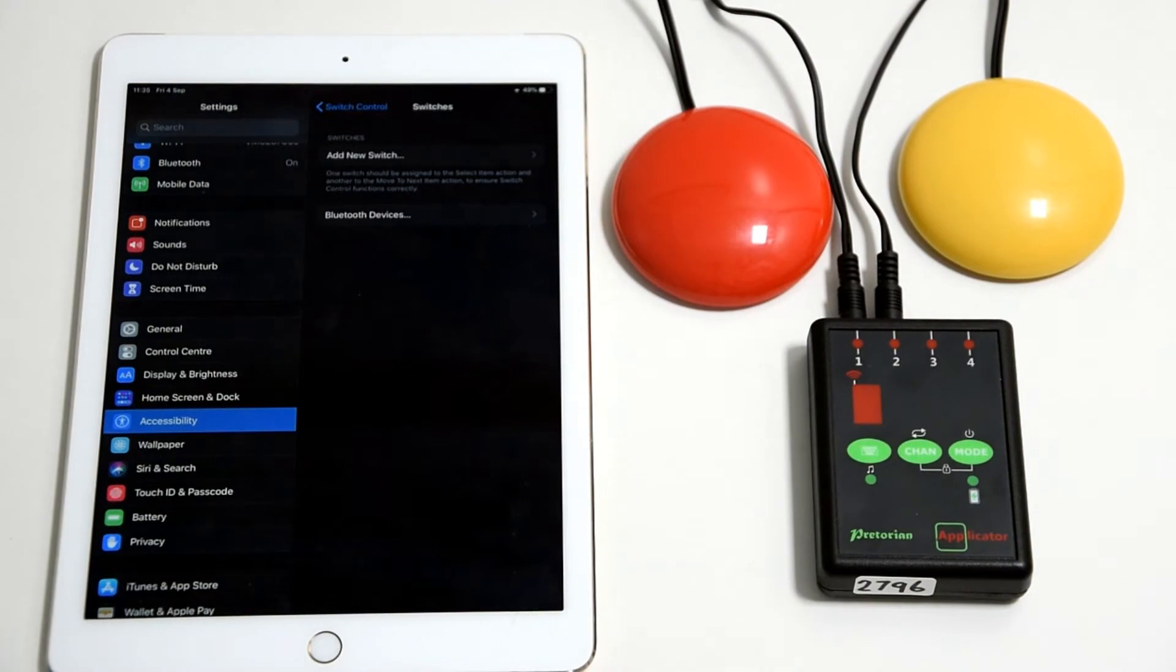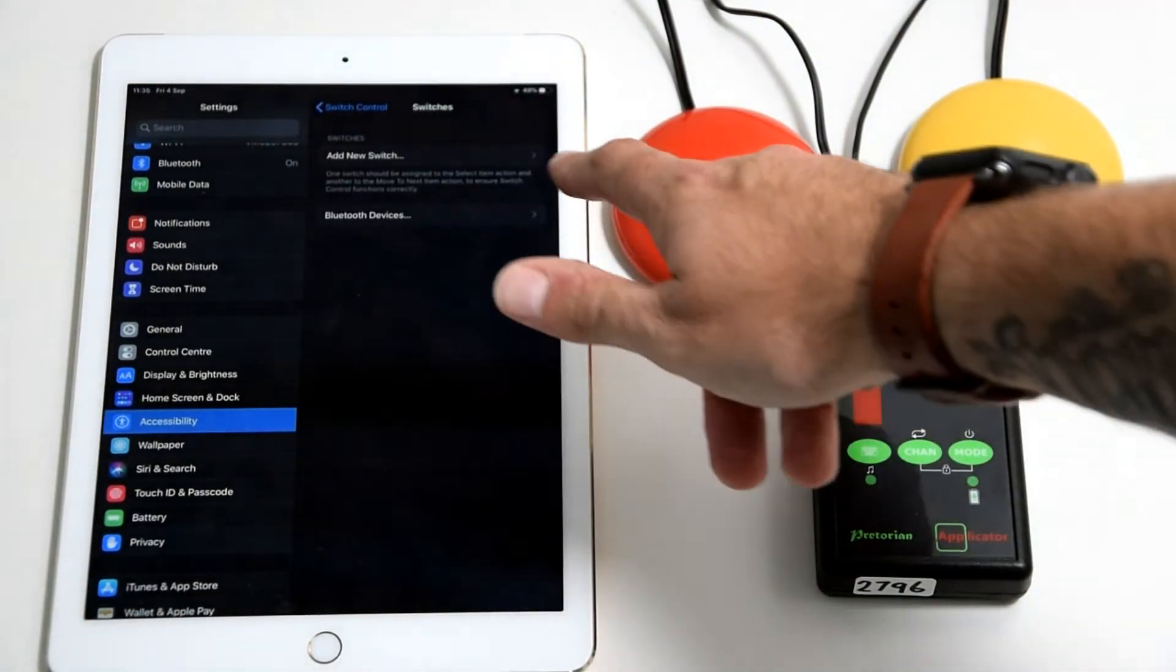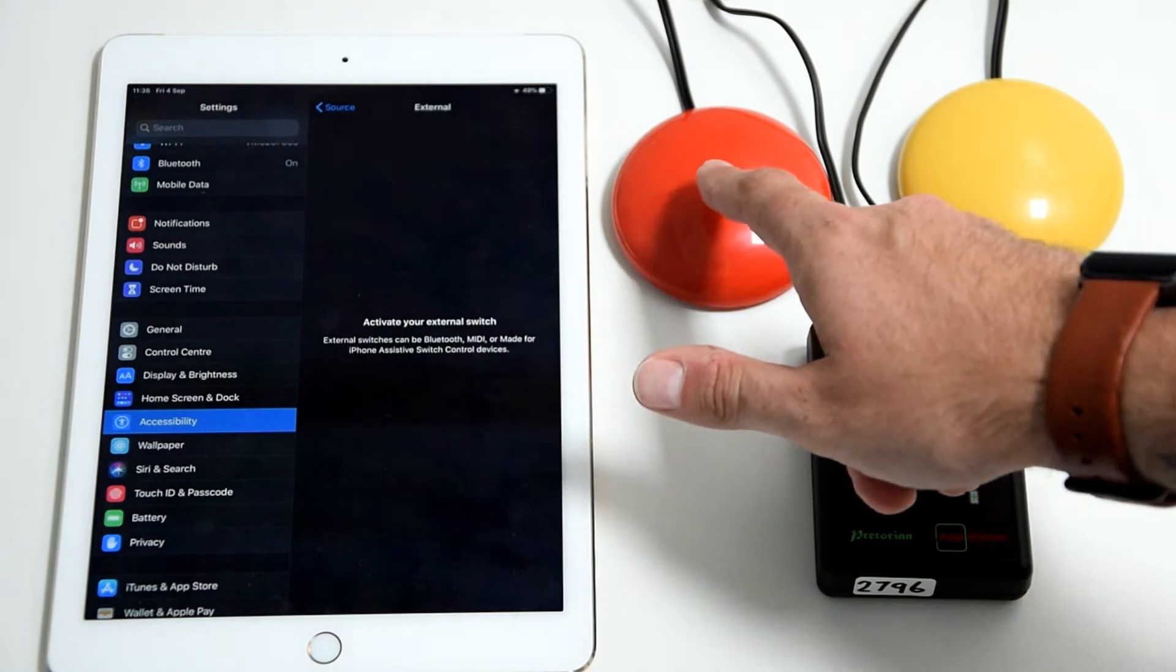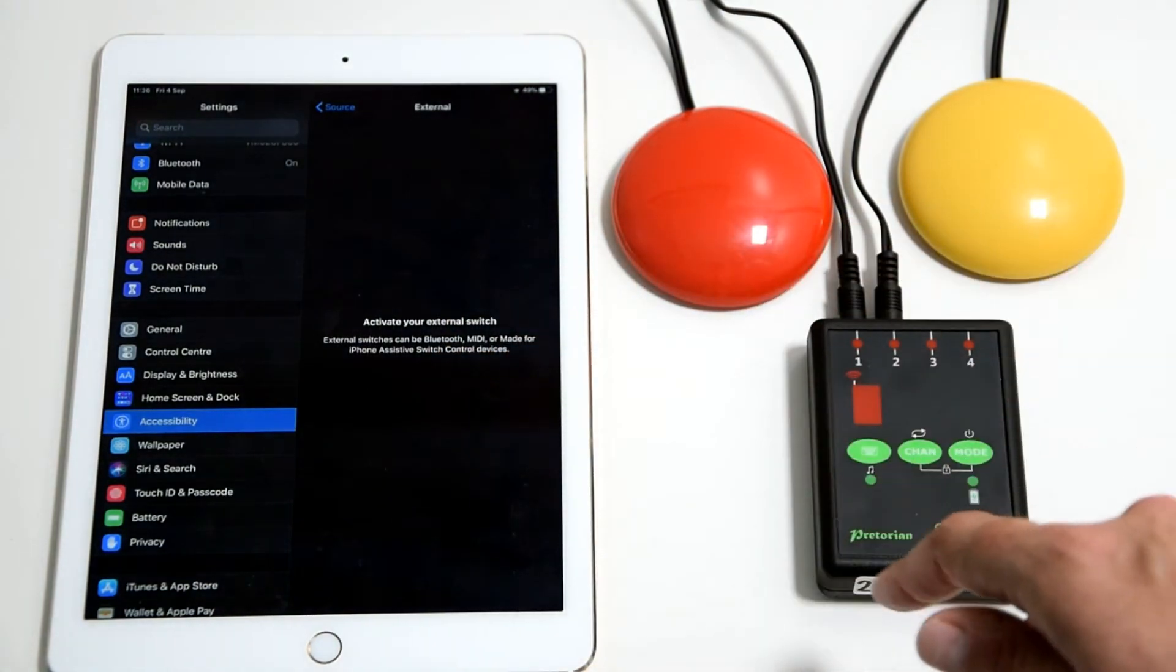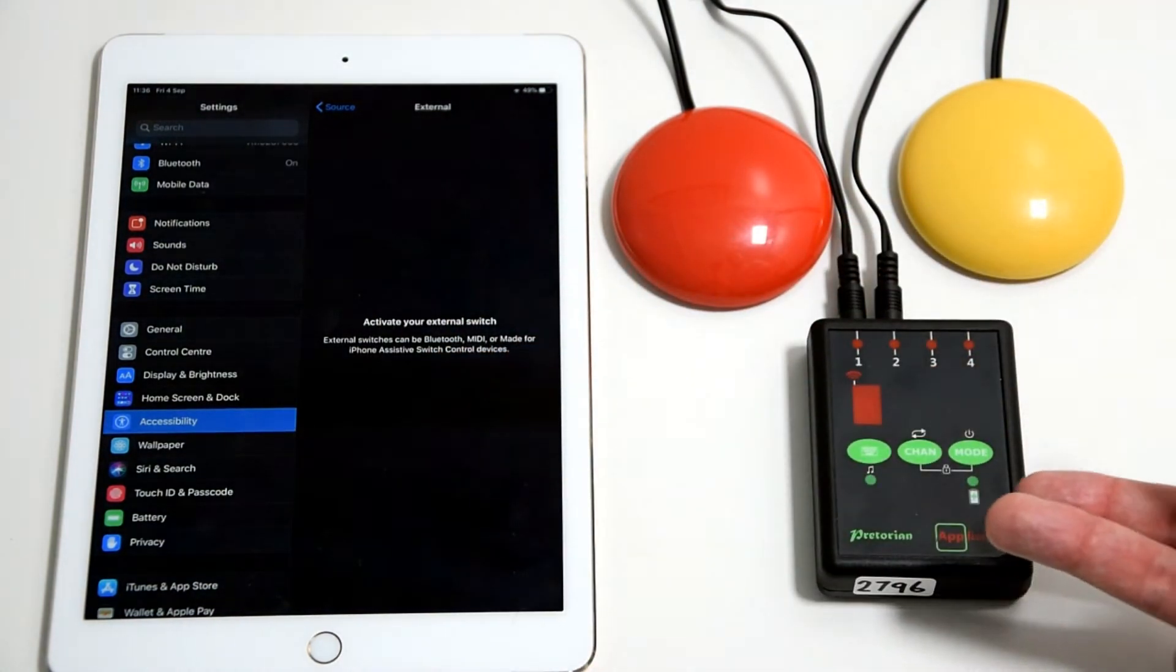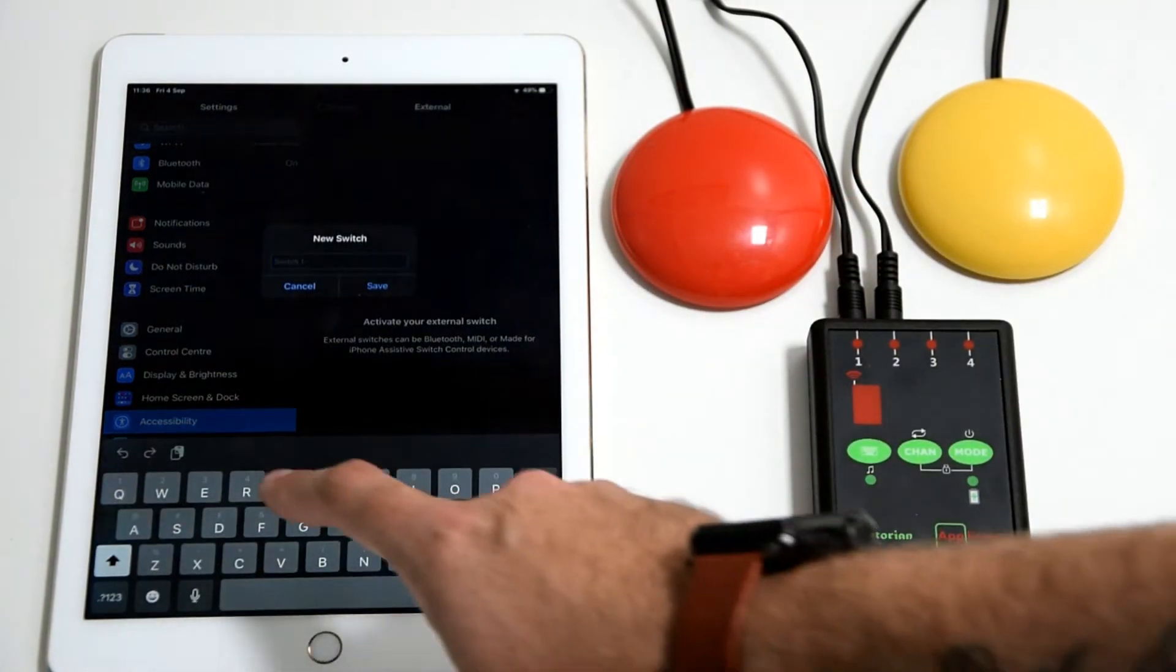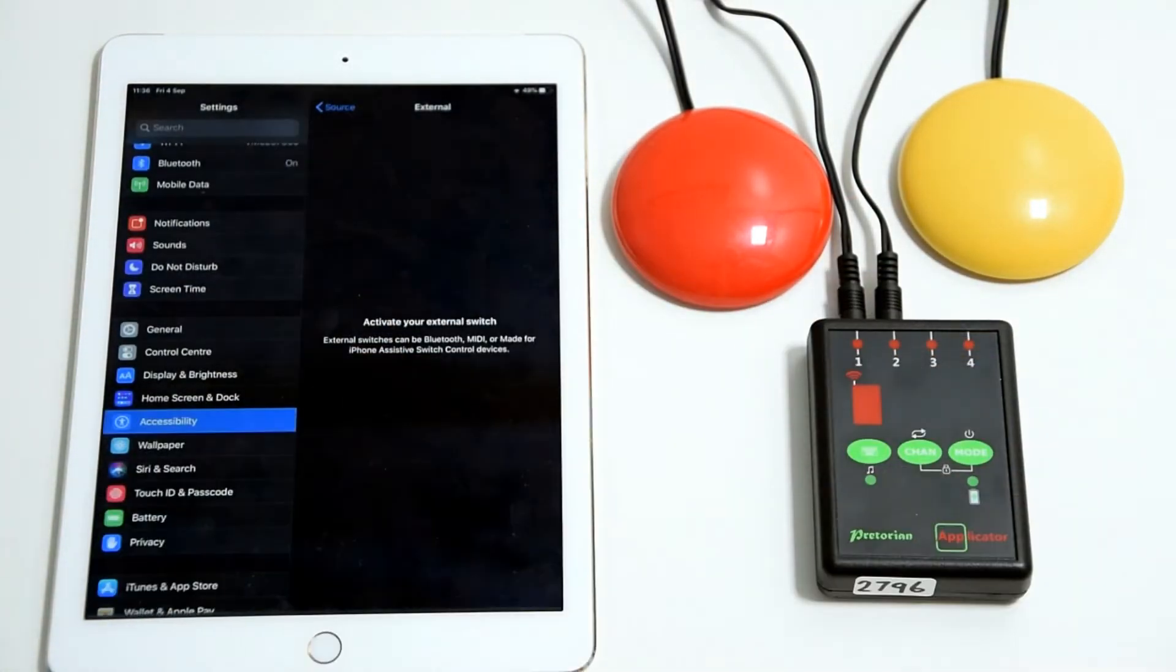You click switches and then you'll see there's no switches connected, so we click add new switch and external. At this point here, this is where you need to activate your switches. They're plugged in, the applicator's on, so you simply press the switch. You can call it whatever you want, but for sake of argument I'll call it red.